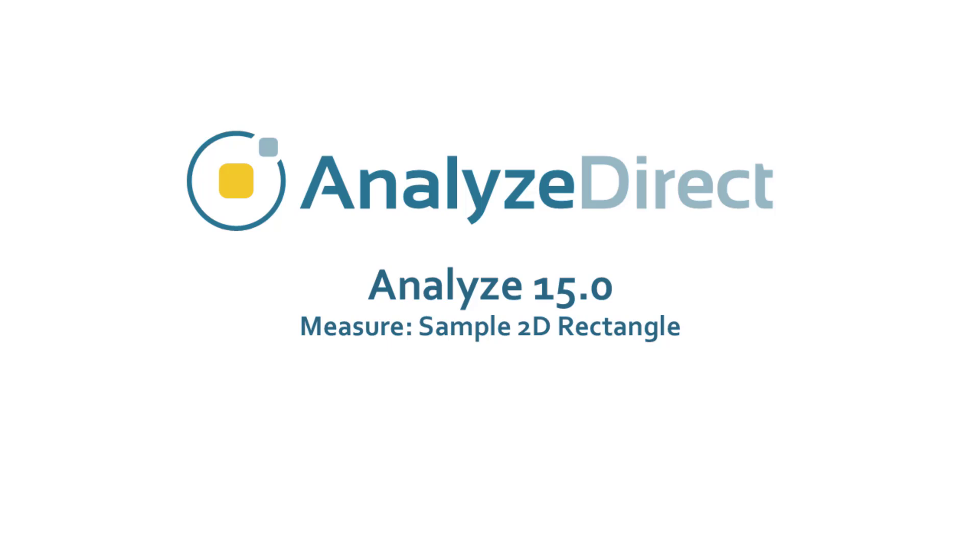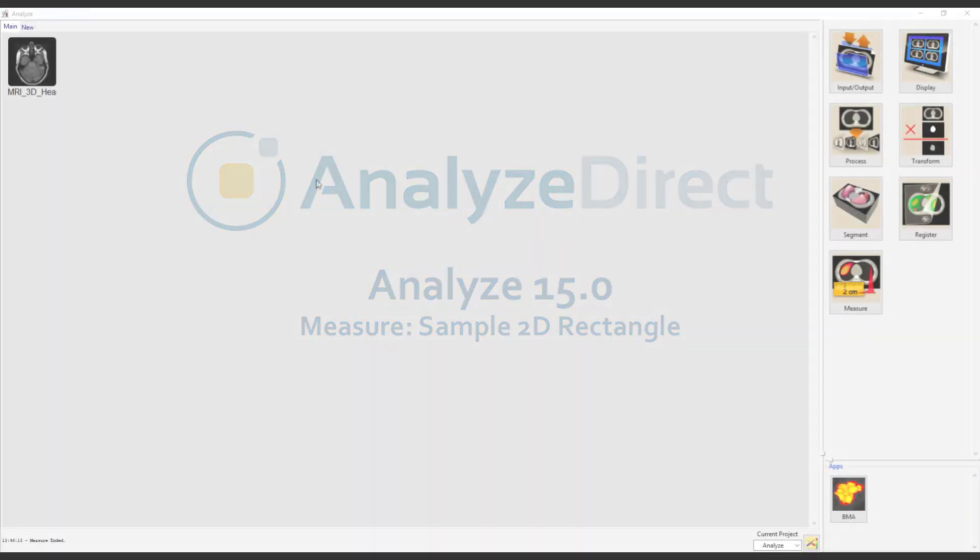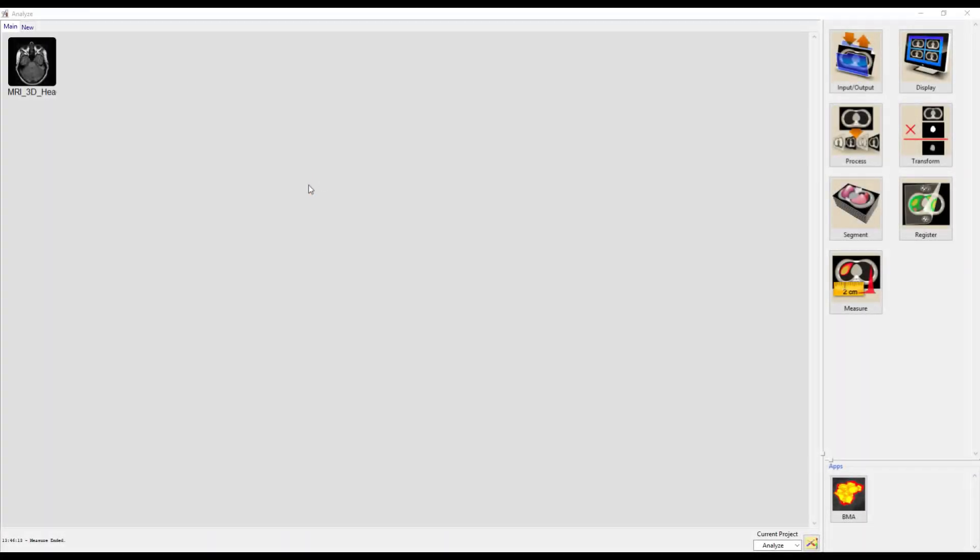The Sample 2D Rectangle tool in Analyze enables the drawing of a rectangle on the displayed image to define a region. Here we will draw a rectangular region on a head MRI dataset.